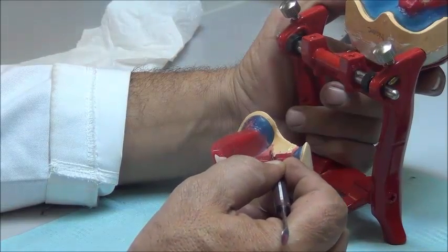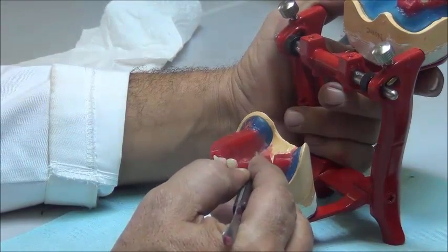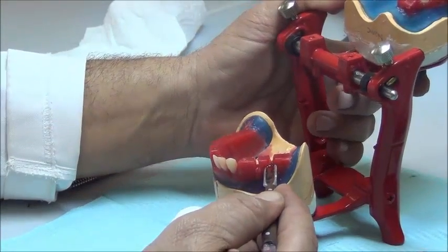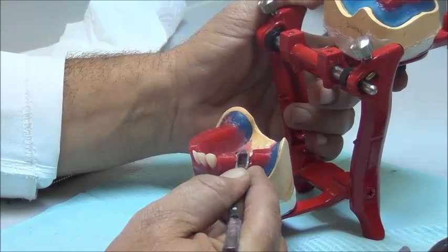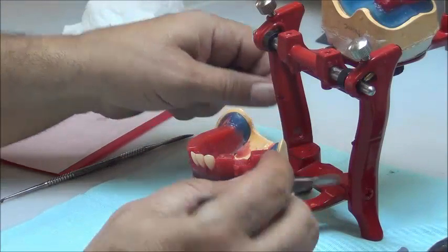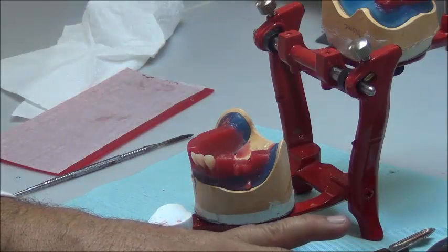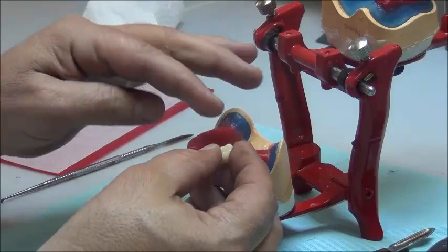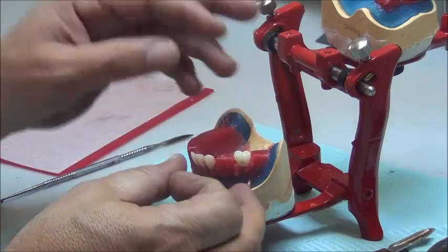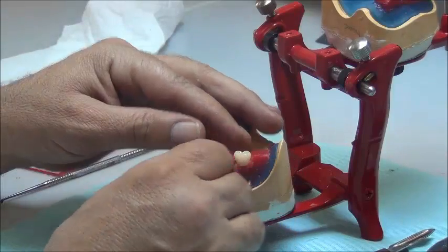So after marking where its location should be, we open a box for the tooth and then we set it into the location. The first step is putting the tooth in correct relation with the upper in terms of cusp interdigitation. Once more, please observe your morphology. So the tooth is put into place. We check with the upper that the location is correct in terms of cusp interdigitation.